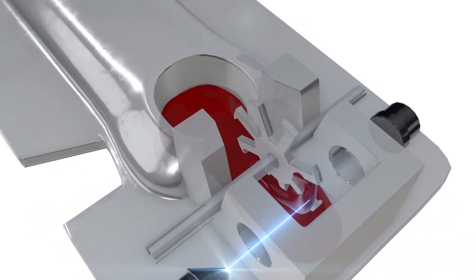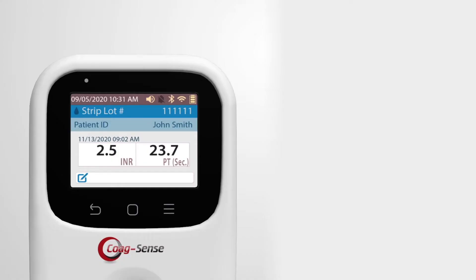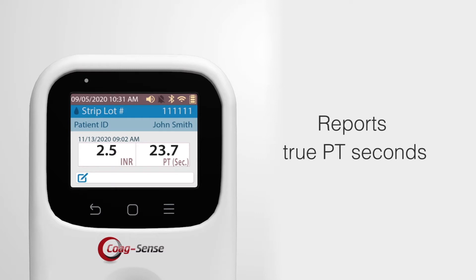Since the system directly detects the clot formation, it reports true PT seconds, offering lab quality results from the convenience of your home.